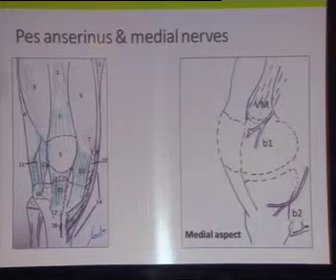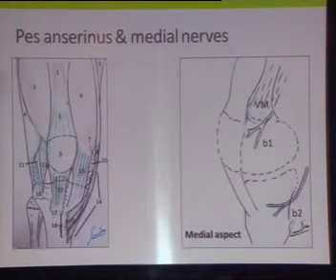Now in my own hands, in the last 1 year, what we have found is that the oblique incision is giving much less neural injuries as compared to the vertical incision. When I was making vertical incision, we had a lot of patients coming with paresthesia or hyperesthesia on the lateral aspect. So oblique incisions probably help in saving this nerve.